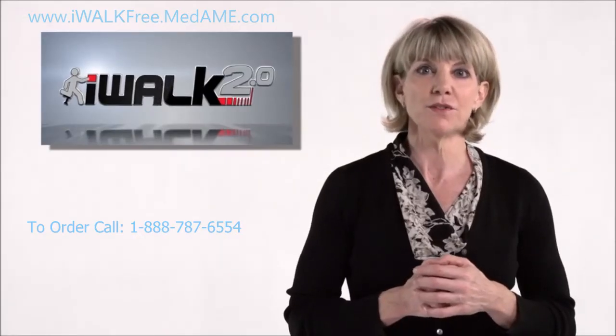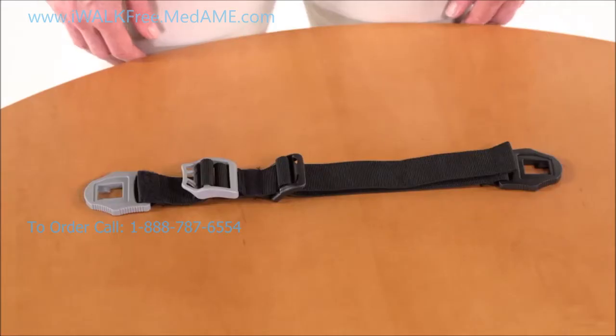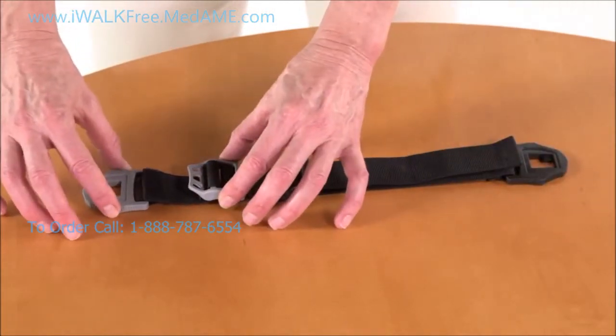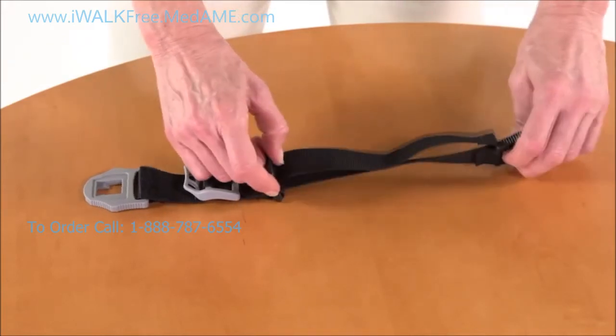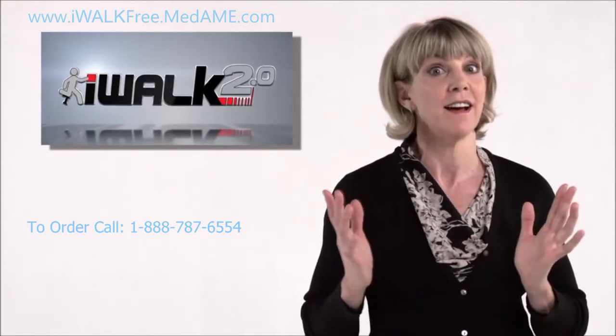Next, we're going to install the straps. The straps have two sections: the length adjustment section and the donning and doffing section. The length adjustment section, which has the black buckles, is used for adjusting the length of the strap to fit your leg. You should only have to adjust this one time, then you're done.